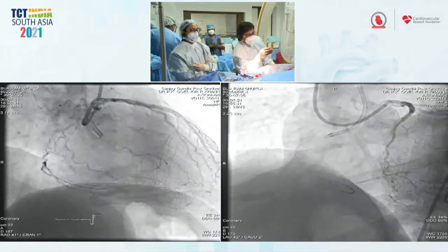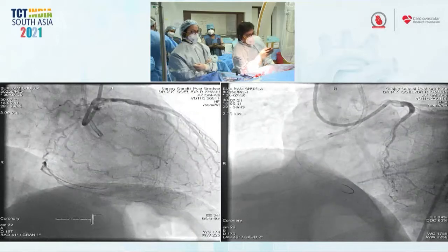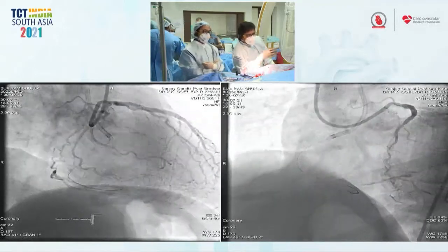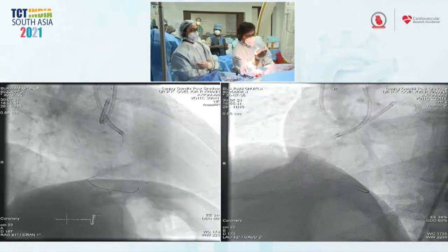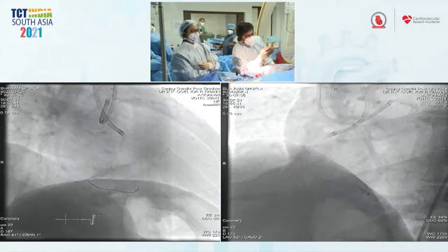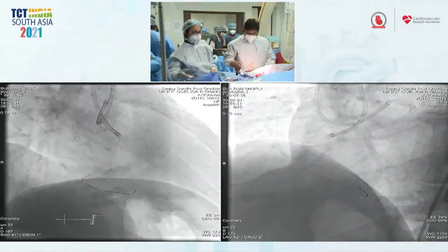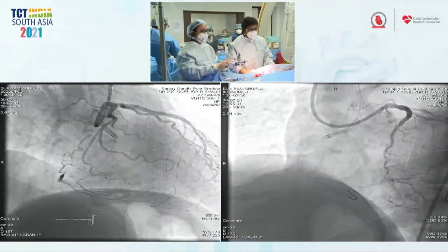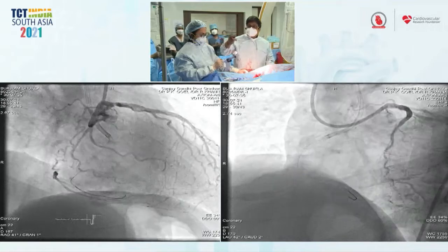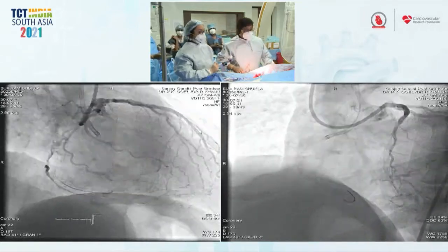So now what I want is I'll probably do it with a 3.0 balloon, and maybe I can even do an angio with a short injection, no problem, after having done with 3.0, and then put stents. And I think it'll need some long stent, maybe 2 of 38 or 40 or something like that. So that's what I'm going to do. I wonder if there's time, you can wait with me. But otherwise, this main thing is done. I'm sorry I couldn't show the OCT because, you know, CTO takes time. That's the issue. Of course.